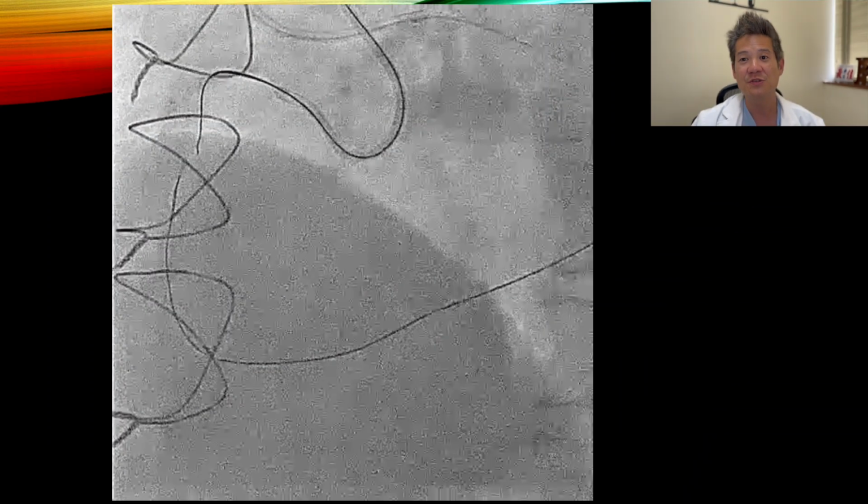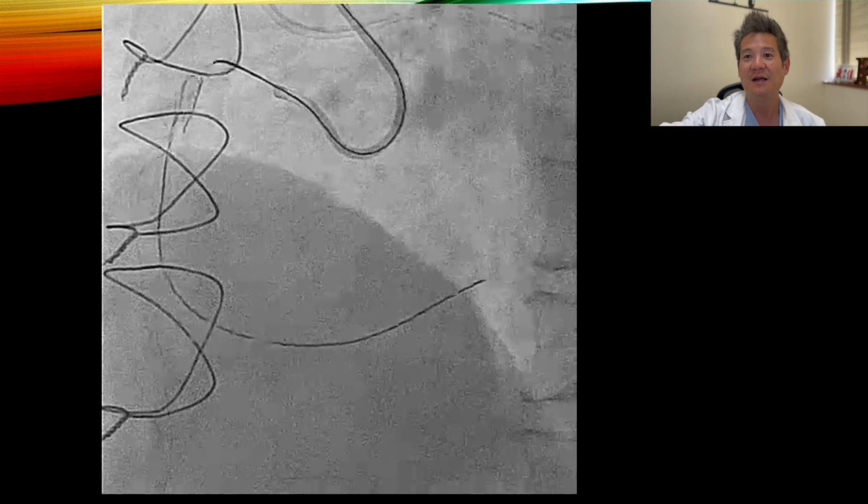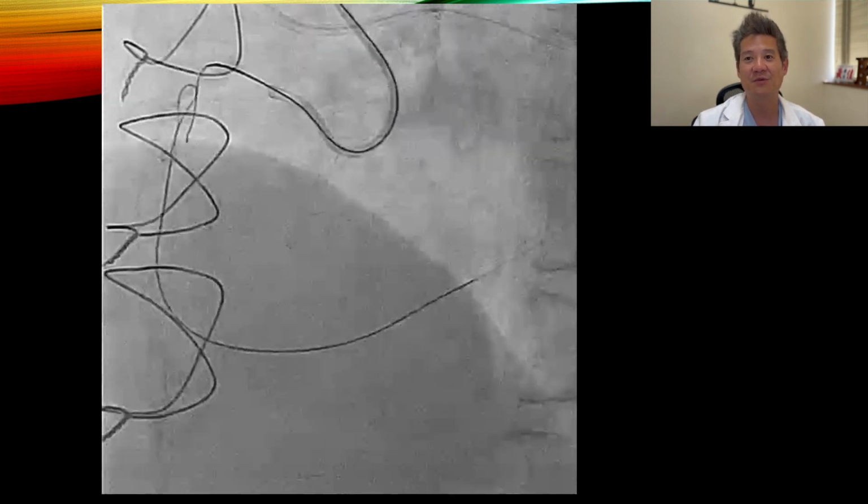And I tried to knuckle it harshly so that it goes into the subintimal space. The first bit of the knuckle, you notice, is quite a small knuckle, so it's probably still staying within the intraplaque space, but at this point near the mid RCA, the knuckle becomes big, and you see we are probably in the subintimal space.